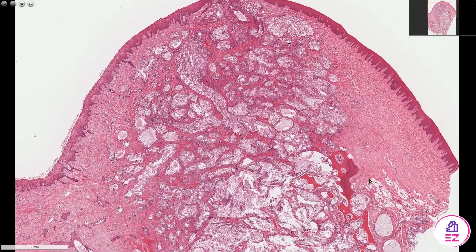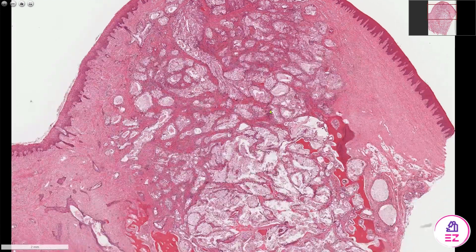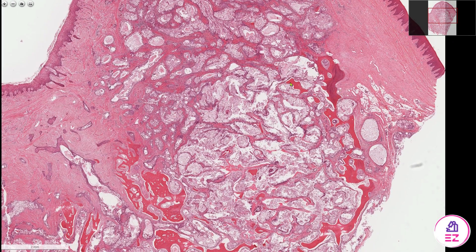This is a retromolar excision covered by stratified squamous epithelium, and then the connective tissue has been effaced by the mucoepidermoid carcinoma. These bright pink trabeculae of bone represent residual parts of the mandibular bone. Much of the mandibular bone has been destroyed by this tumour, which is in keeping with a malignant process.